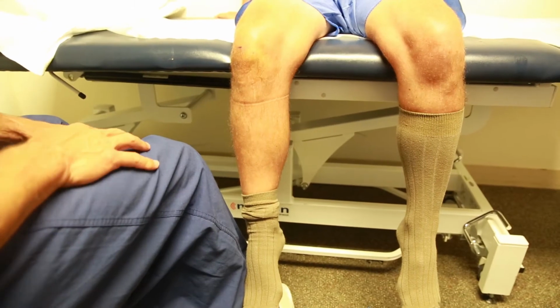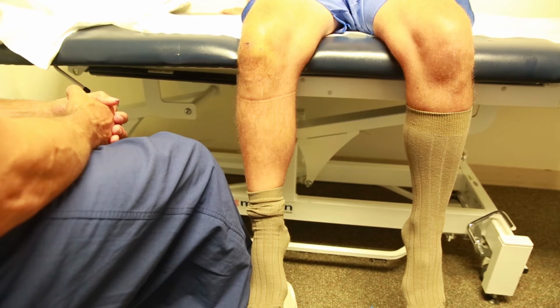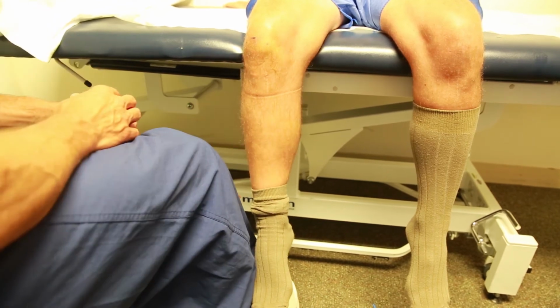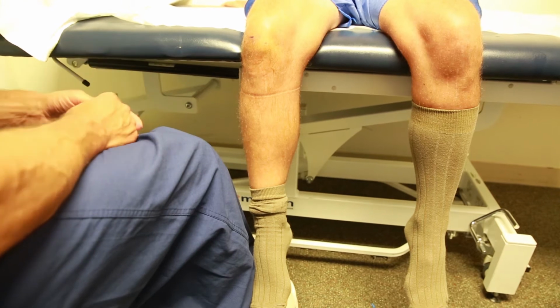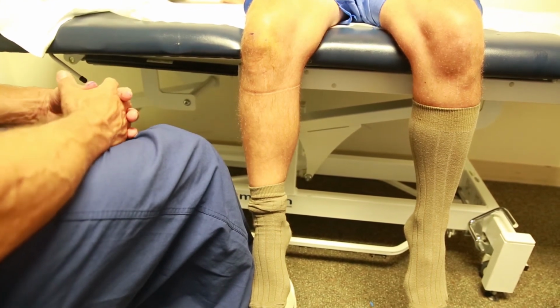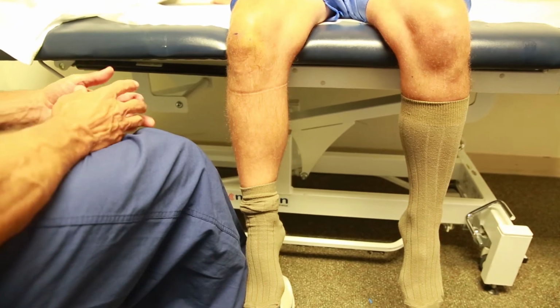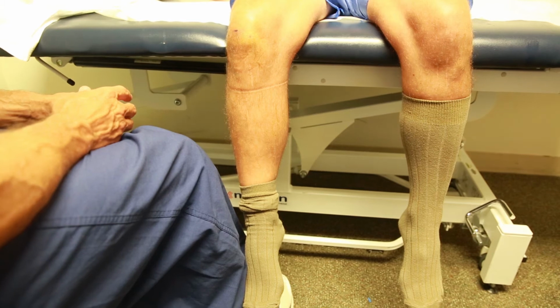An alternative way of doing this, and how I used to do it, is have the patient seated. One of the advantages of this, we used to think, is that there would be some gravity distraction of the knee joint. But the knee's at 90 degrees, and oftentimes this makes it a little difficult to see the posterior aspect of the meniscus. And if you think of it in the operating room, we usually don't scope the meniscus at 90 degrees. It's great for the ACL, but not for the meniscus. It's comfortable for the patient because they can sit there, lean back if they want. They can even lie flat and do it this way.